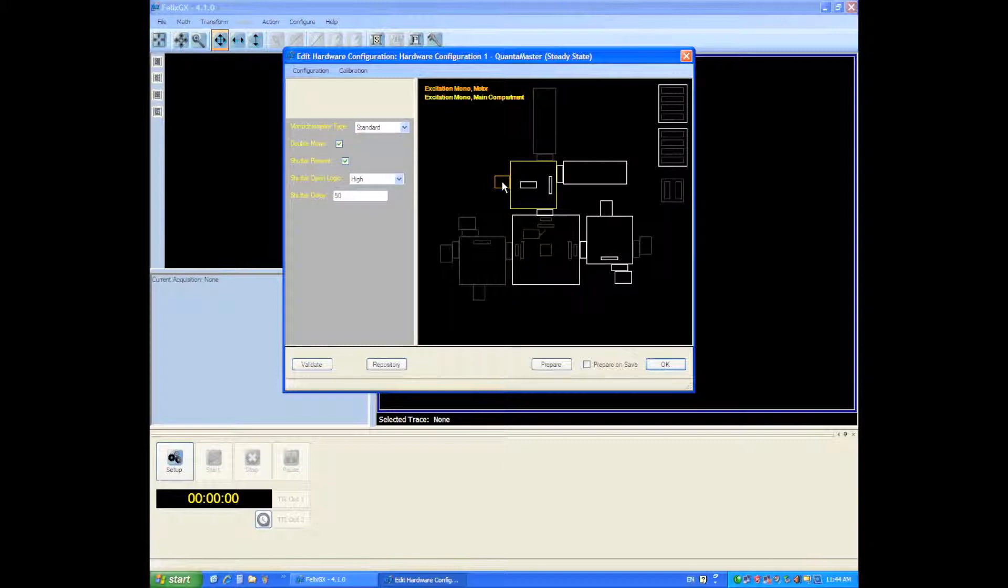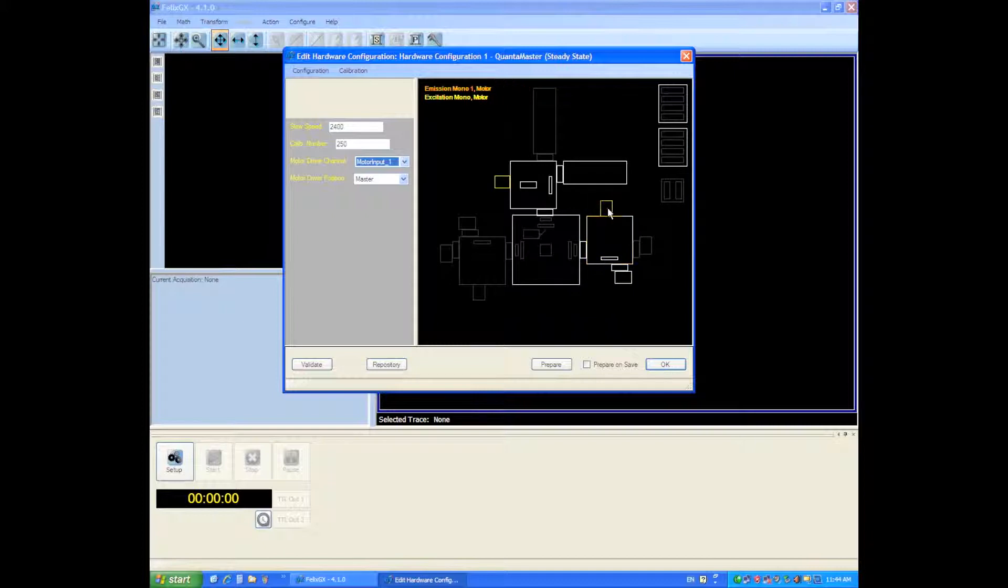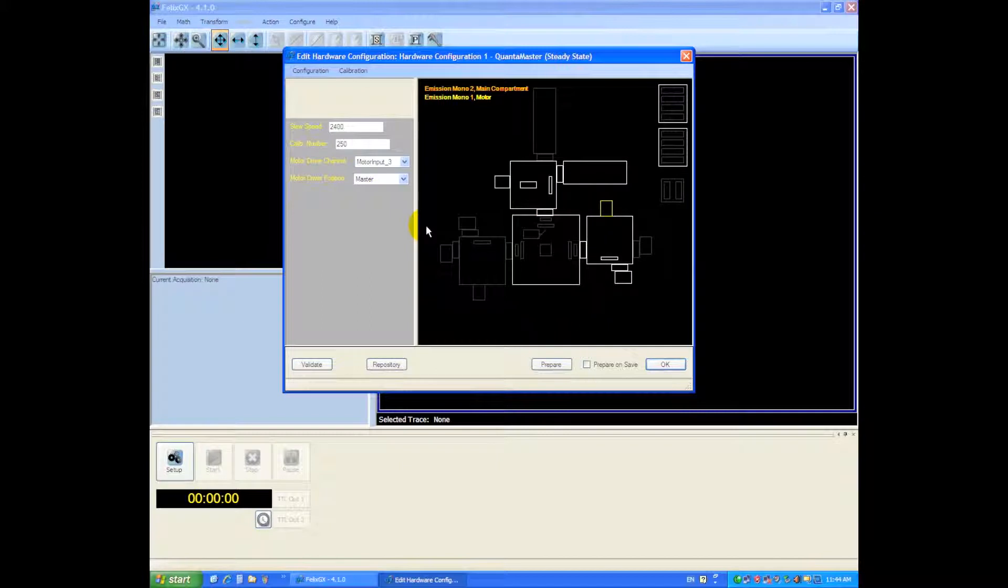Next we'll move the monochrometer motor to channel 1. It's the default position and the emission monochrometer motor is going to be configured to channel 3 and next we'll configure the detector.